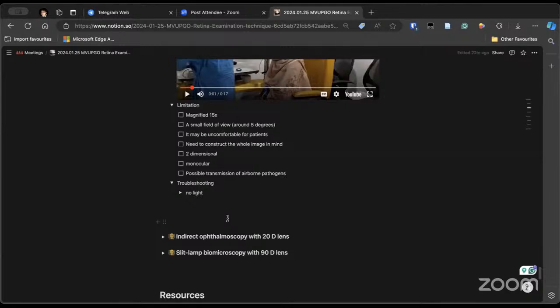There can be, sir, a change of filters in between. Yes, maybe in between that. That is very important. Sometimes even in my slit lamp, you are looking and not seeing anything, because the filter or magnification is in between. So that is a very important thing.